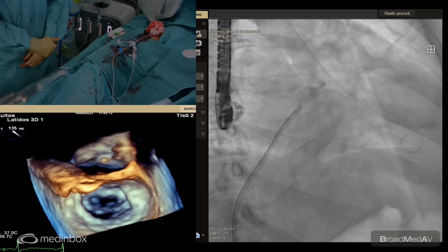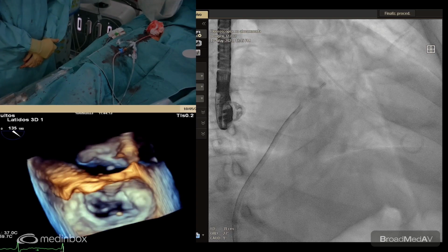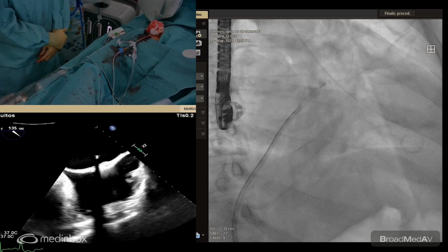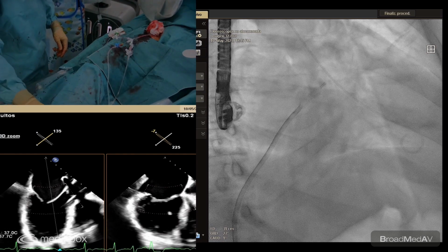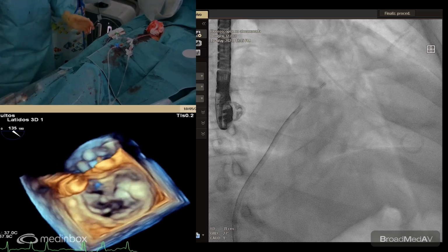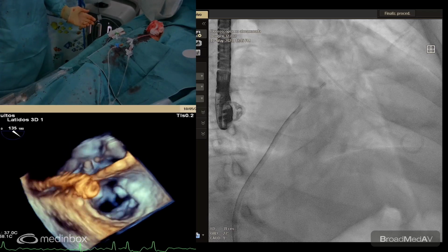Gradients don't matter. I mean, you can see in the image that the valve has clearly increased massively, especially in the mobility of the anterior leaflet. I prefer the new way. And also these funny calcium nodules as well. Well, the funny calcium nodules, I hope they're still there. Yeah, look, the posterior leaflet is there. Calcium is there. But the commissure is open better.